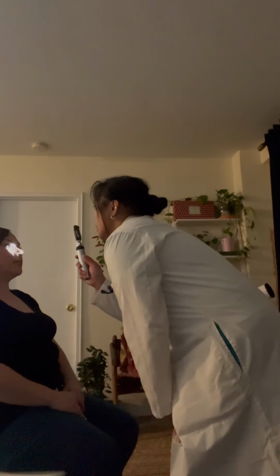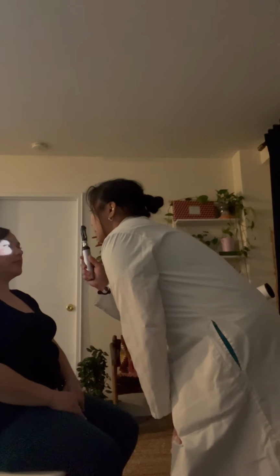Okay. Please look at the wall in front of you. Okay. Red reflex is noted bilaterally with no opacities. I'm now going to look at your right eye with my right eye while I hold your head for stabilization. Retina appears to be orange, no edema, no AV nicking noted. Retinal vessels intact, disc margins appear sharp. Horizontal diameter of cup is less than half the horizontal diameter of disc with a 0.4 disc ratio.